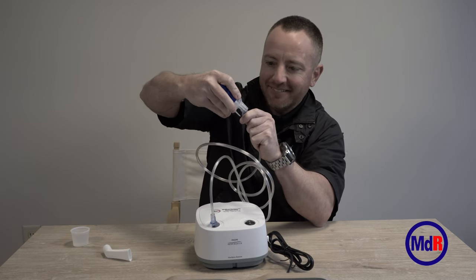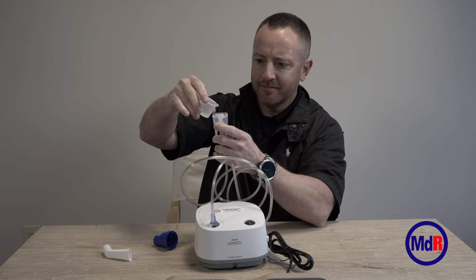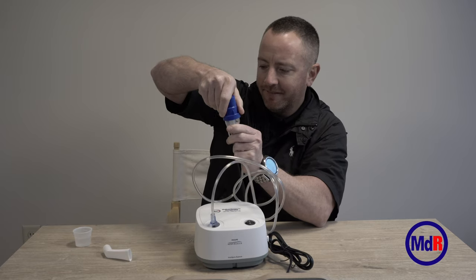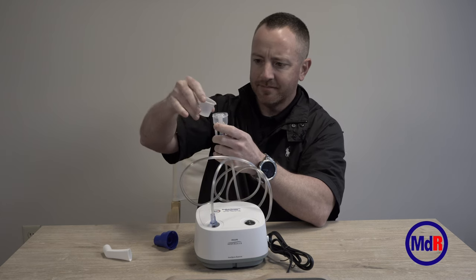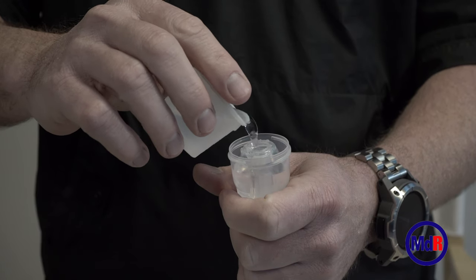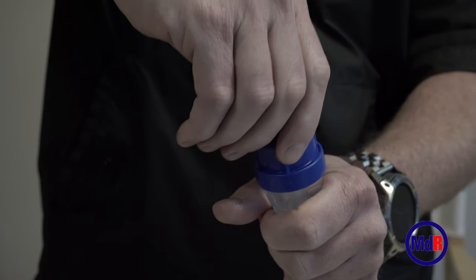The next step is to add the medicine, and you need to make sure you wash your hands thoroughly before doing so. The other end of the tubing goes into the bottom of the circuit, which is the medicine cup. You can either twist off the top and add the medicine, or put the medicine in through the top of the medicine cup — there should be a hole at the top. The medicine you use will be different than what's shown here; you'll get that information from your local pharmacist and/or your doctor.